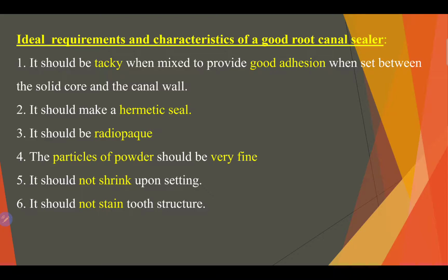It should make a hermetic seal. What's the meaning of hermetic seal? The meaning of hermetic seal is tight seal.